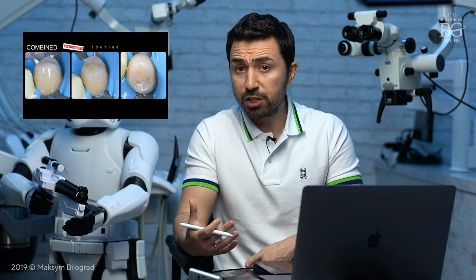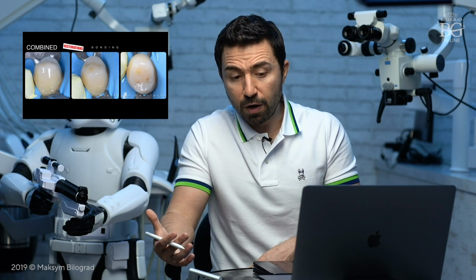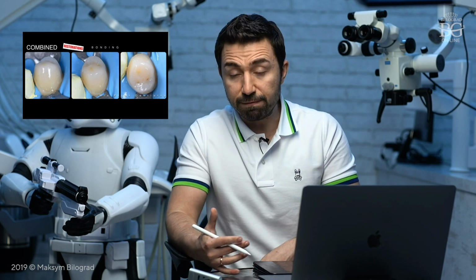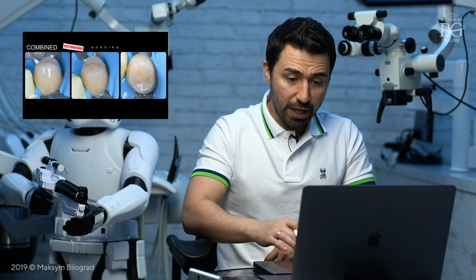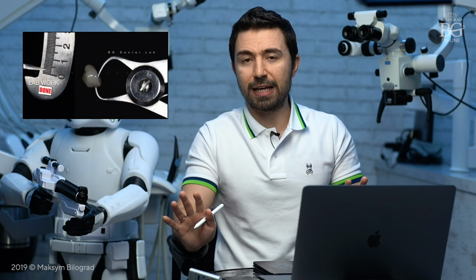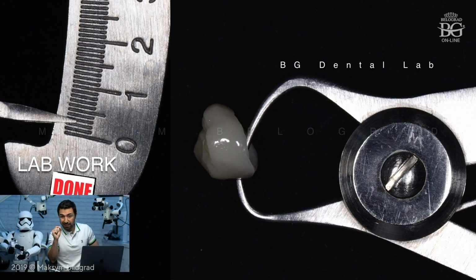They also have some cases of a hybrid restoration, where they bond ceramic to composite with long-term survival rates, with clinical experience and follow-ups of more than 15 years, which is really amazing. So in that case, the bonding process was with rubber dam as well. You can see the thickness of the crown. It's completely against the rule, but I would like to mention one thing.